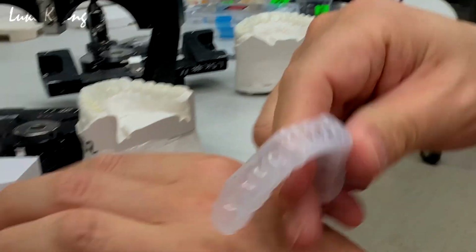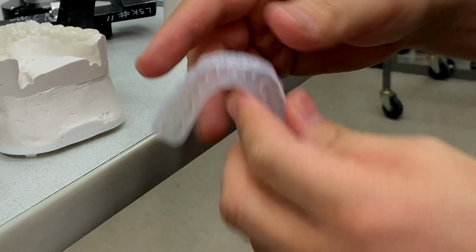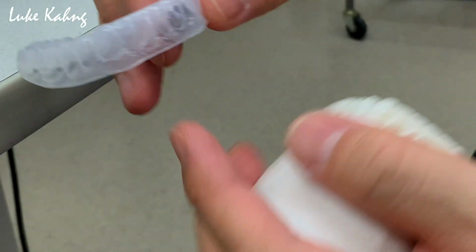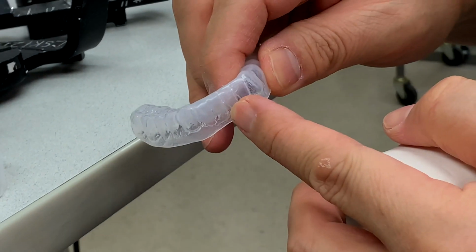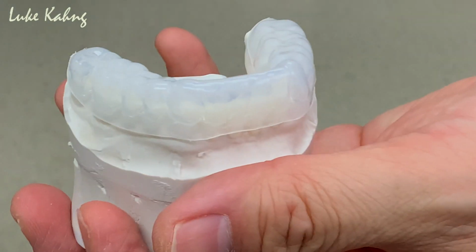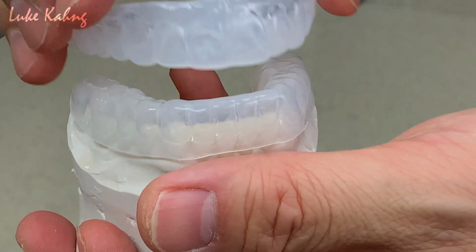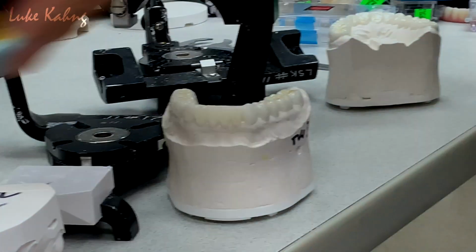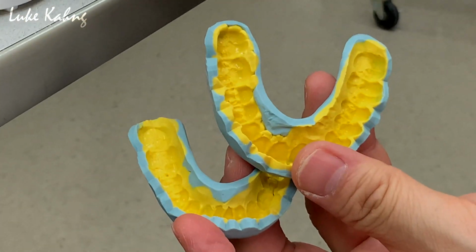So we make the stents, about 4mm stents. So there are two purposes they can do. They can see the prep guide, they can make the hole, or they can use it for temporary. But they can see it in the patient's mouth, just like that. Two purposes. Now the other one is putty. We make the double putty, we call it special putty.